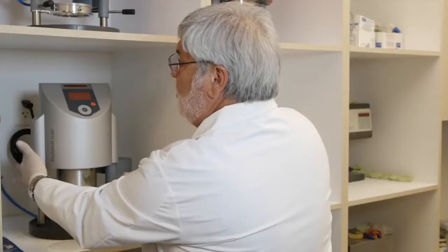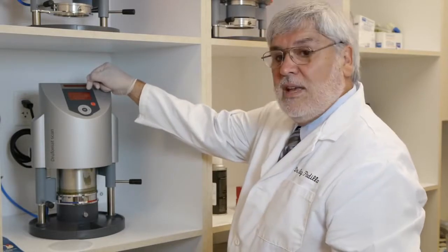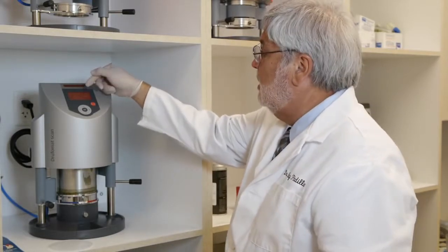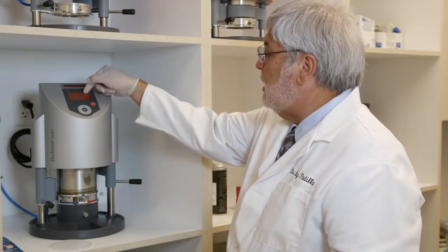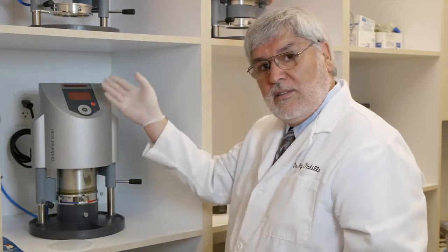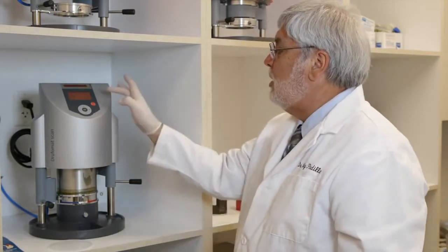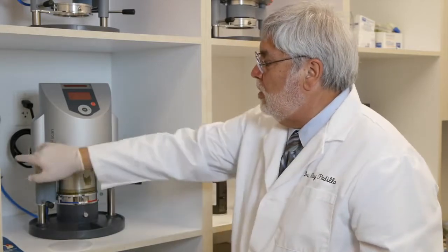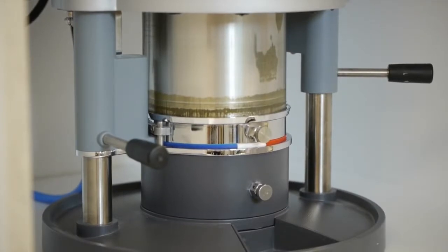Now you heard the second beep. Now I can let go. Now the heating time says 0 because it's already heated. Now the cooling time is 6 minutes, so we're down now to 5:48, 5:47, etc. So now that's going to go down to 0. Once this goes down to 0, we can open the cylinder and you'll have your pressure thermoformed first layer.